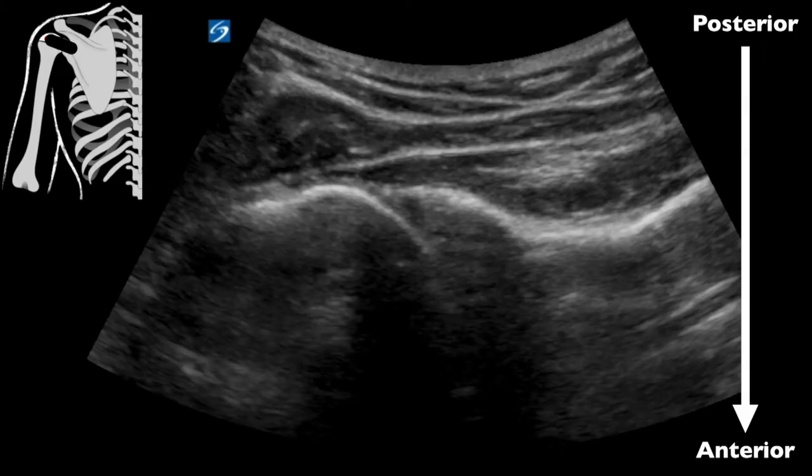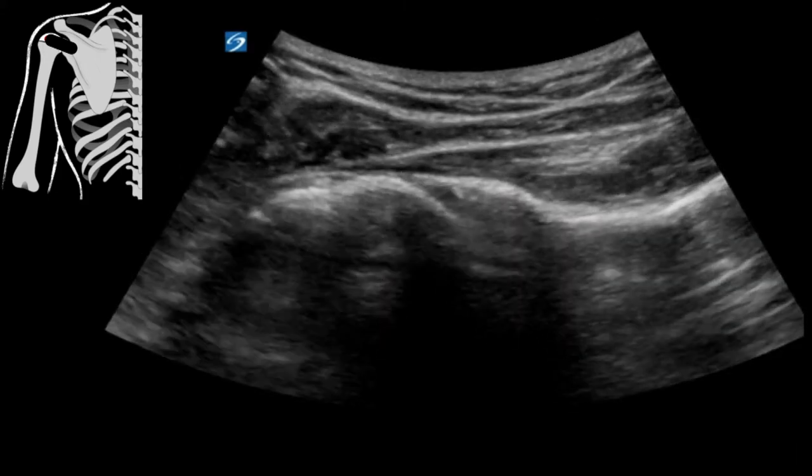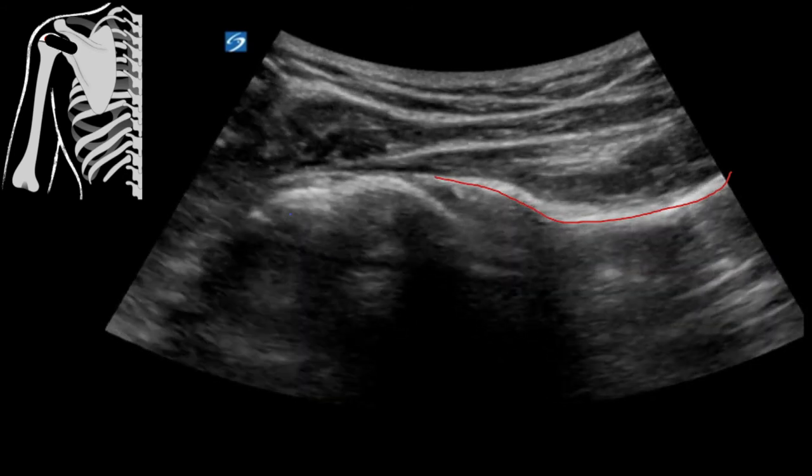I'm going to look for an image that looks something like this. Remember that because we're at the back, this is going to be posterior to anterior. Here's our scapular spine and our humeral head is right here — we can see those two come together nicely. The nice thing is because we can do this as a dynamic study, we can have the patient move their arm. I just have them bend their elbow, put it against their side and rotate outwards. We can see they're right abutted up next to each other just fine.